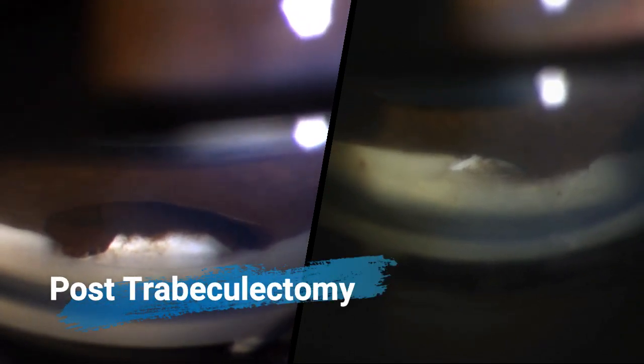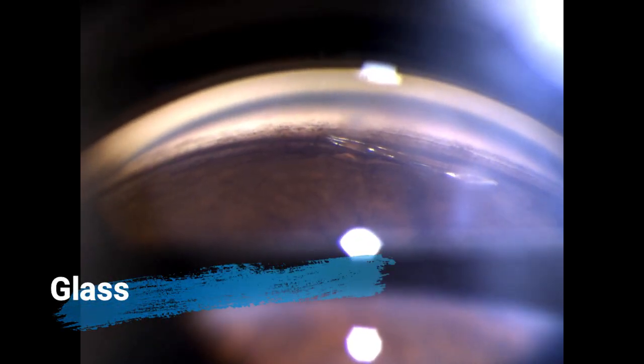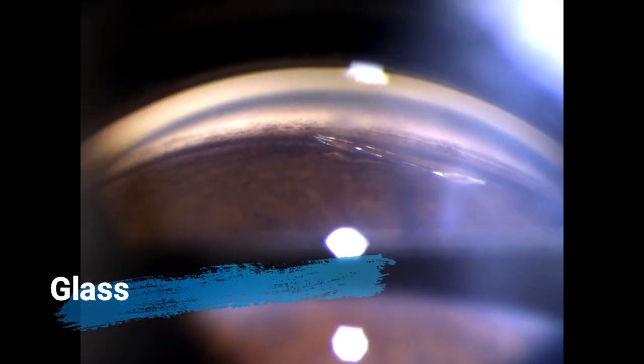Post-trabeculectomy, we can visualize the ostium, whether it is patent or it is getting blocked with iris tissue. We have come across foreign body in the angle. Here we can see wooden foreign body post-penetrating injury. Here is a patient who had a glass piece in the angle post-trauma.